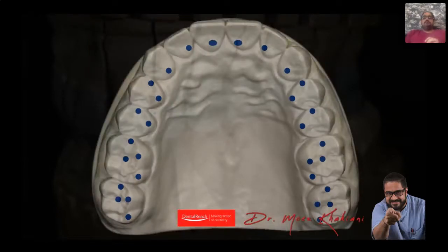Now, what is important is dynamic. What you do in dynamic is you put your horseshoe paper, tell the patient bite down, clench down, and then slide the entire jaw forward. When the patient clenches forward, I ideally want to see lines on all 4 incisors. Now, these should be continuous lines. There should be no break. If there's a break in the line, it means some tooth at the back is interfering. So you'll have to come in and adjust that.